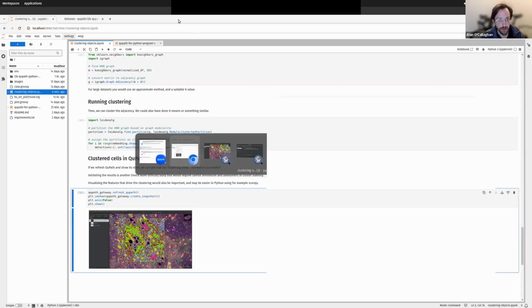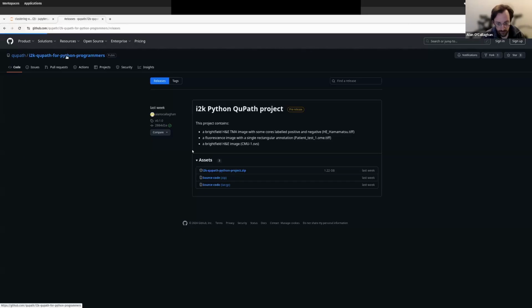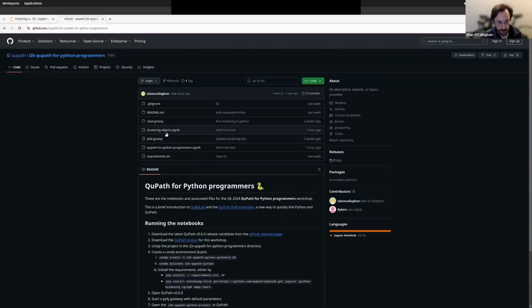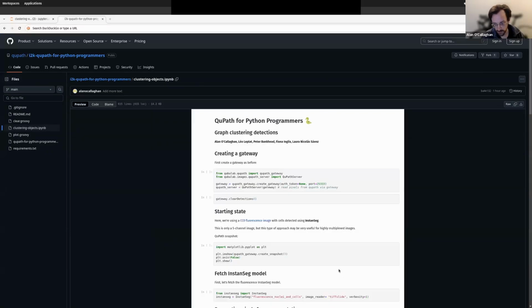So the current notebook is clustering objects. So I don't think I've missed anything. If I have, then do feel free to shout. And if there's any other questions, then please do keep them coming.